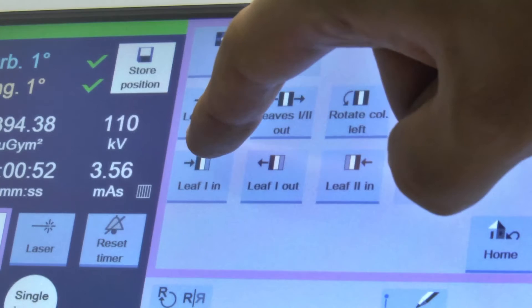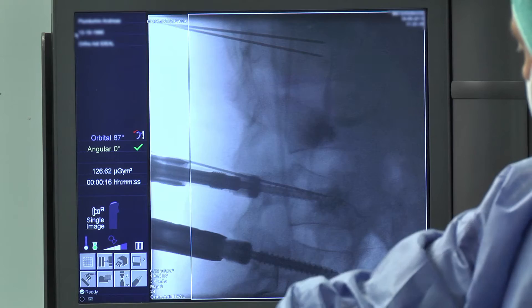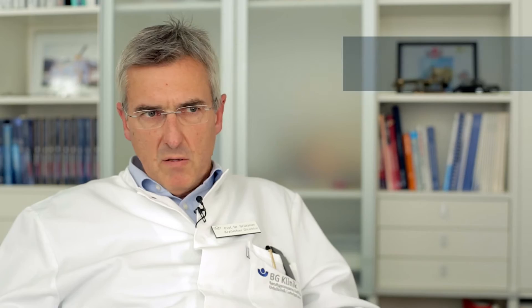The asymmetric collimation of the Seuss Fusion gives us a new possibility and new flexibility intraoperatively. You can leave the C-Arm in place and have the flexibility to decide whether you collimate from the lateral or more from the oblique side. This is much more easy to handle than the conventional C-Arm.